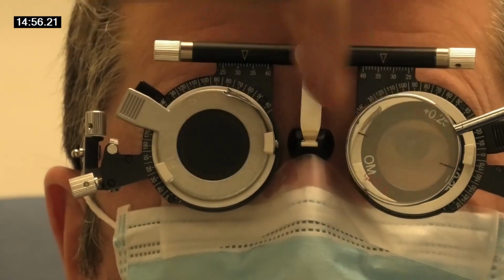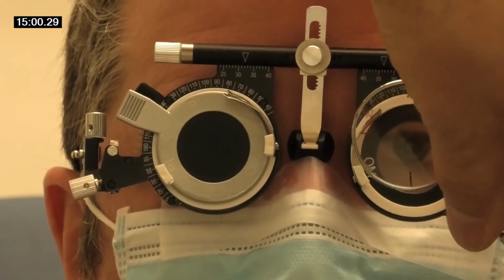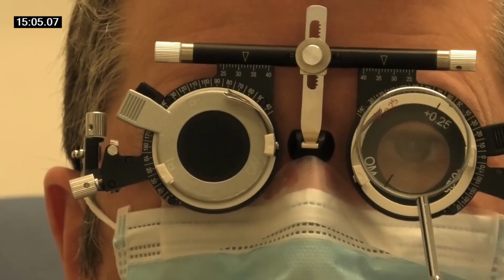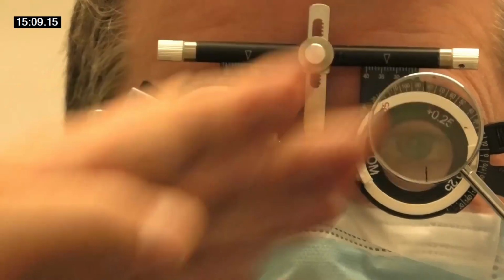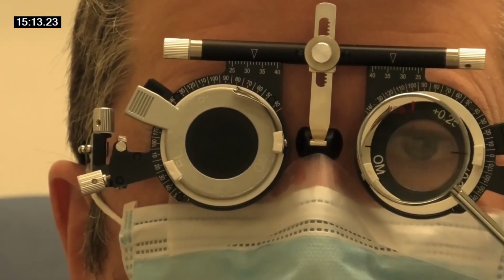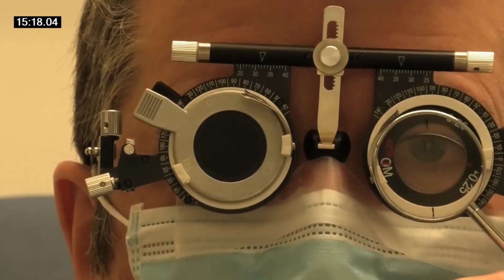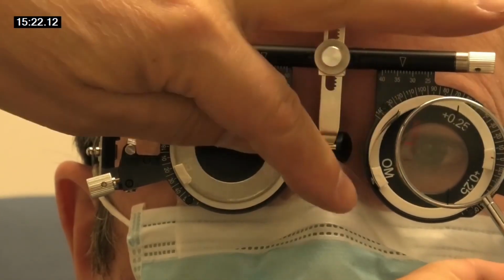So you've done that one and that one, so you've got to do 90 and 180. 180. Okay, is that clear? No, that's right. Okay. Yeah, because you did that. Oh, yeah, that's right. Okay. And is that clearer with lens 1 or lens 2? So he likes this. He likes going that way, doesn't he? Yeah. And he likes this way.